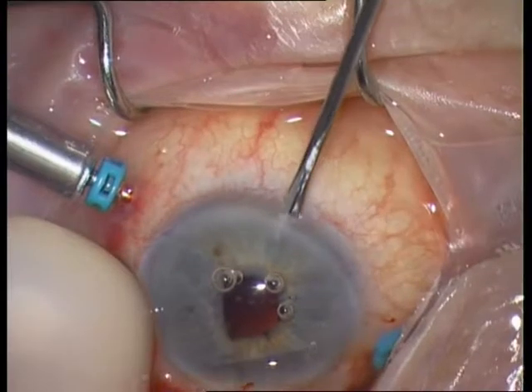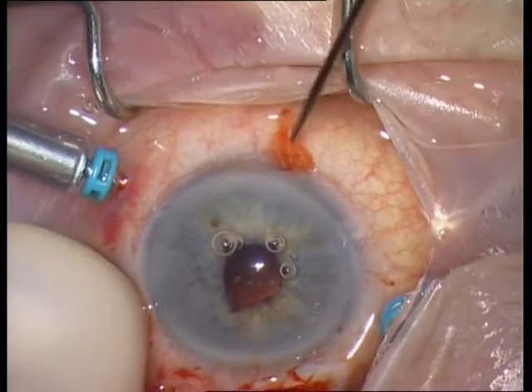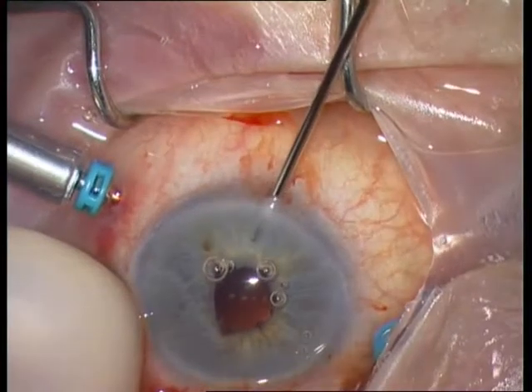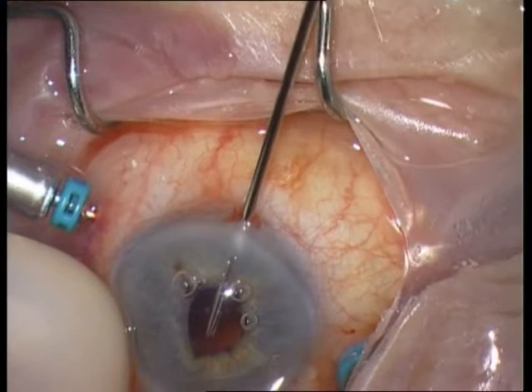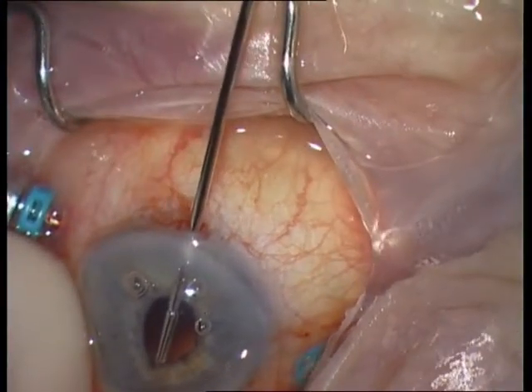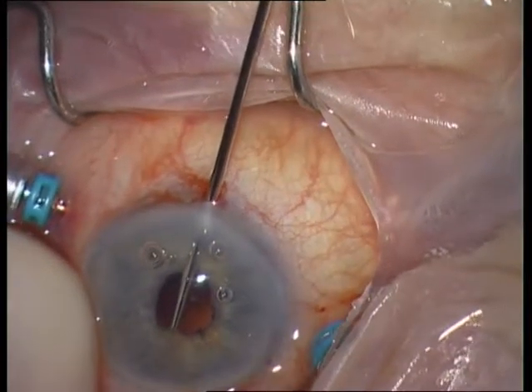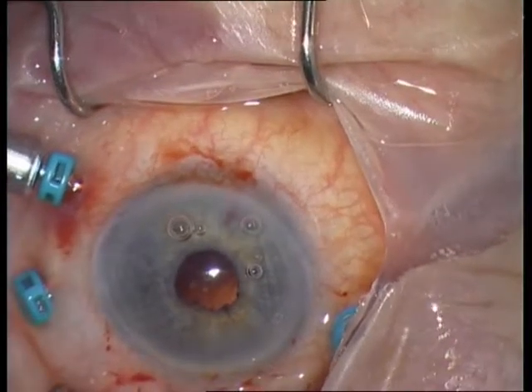I am now trying to fix the ectopic pupil. Paracentesis at 6 o'clock. Insertion of an intravitreal forceps, then grasping the ectopic part of the pupil and repositioning it.